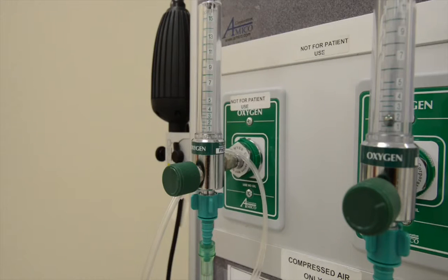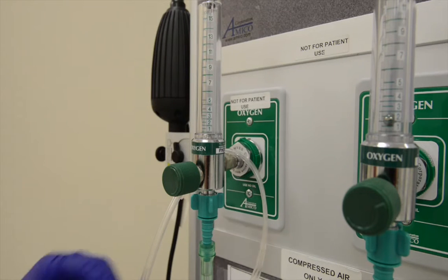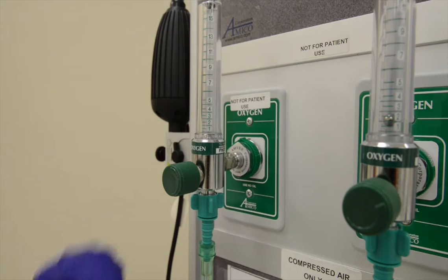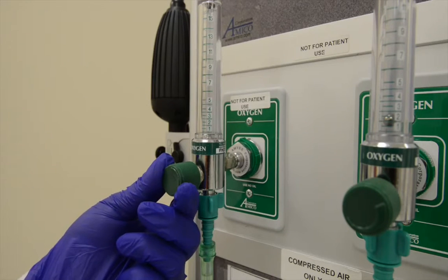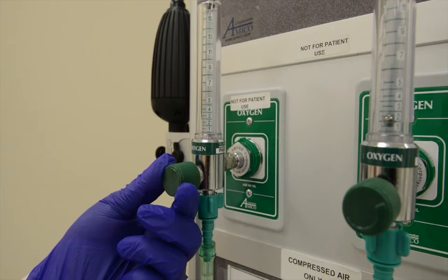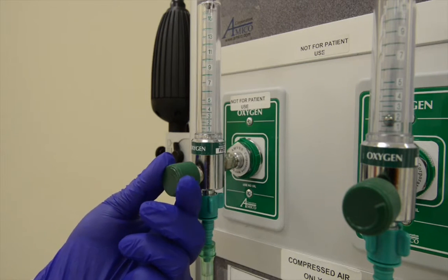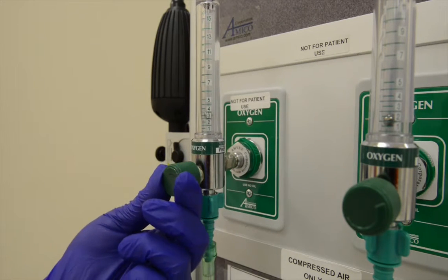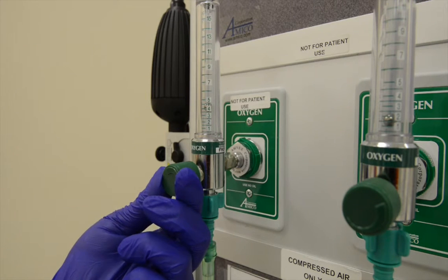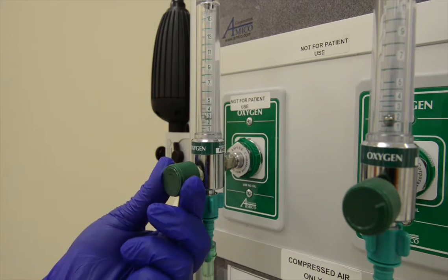To initiate a nasal cannula, on your oxygen setting, adjust the amount of flow. This is in liters per minute based on your physician's order. Turning to the left increases it; turning the knob to the right decreases it.